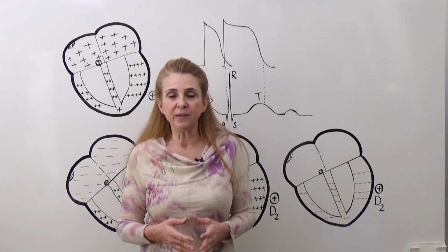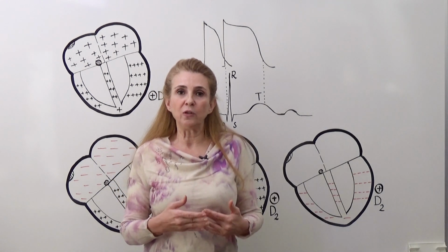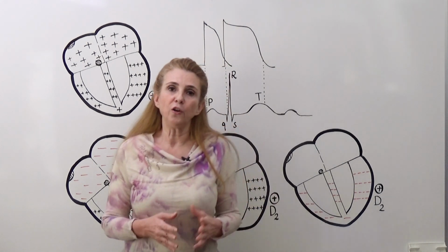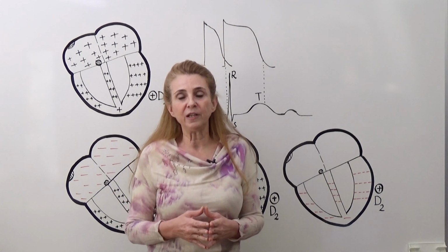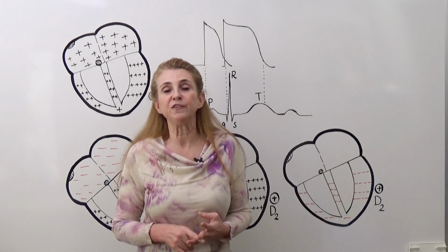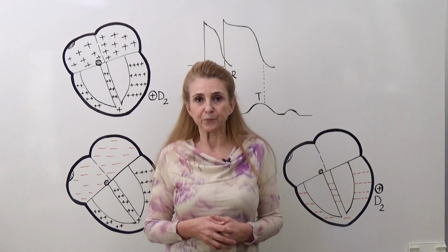And I examined how this dipole is reflected as electrocardiography waves onto these electrodes. For all of the electrodes, the dipole was the same. However, it was reflected as electrocardiography waves with different shapes and different sizes to each of these electrodes.